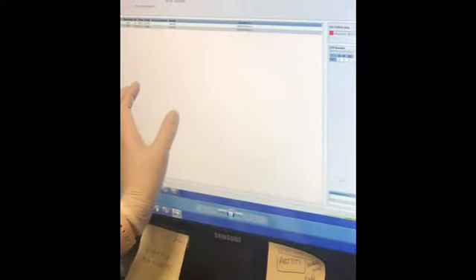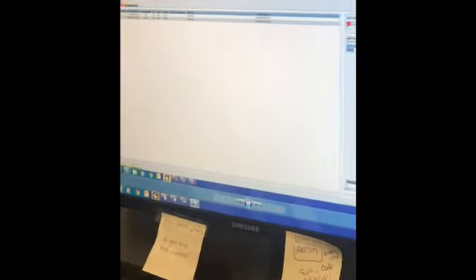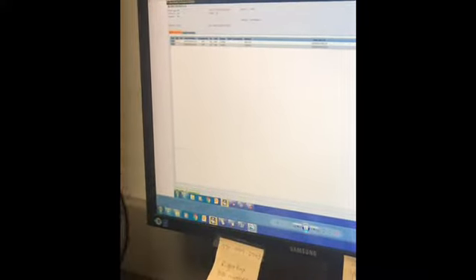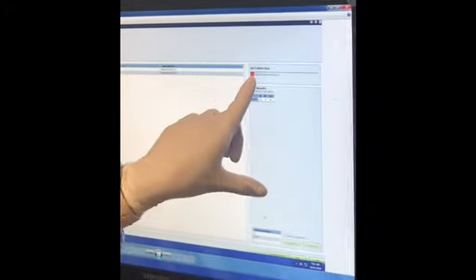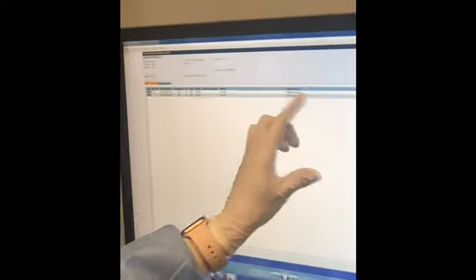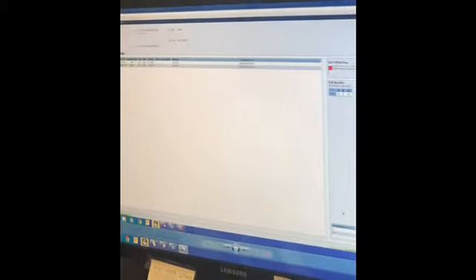That's why I said when it pulls up, verify all your information. It's gonna come from there. Right. Okay. Verify all your information. Make sure everything is correct on how many units you have versus how many you put on there, and that'll let you know if everything has crossed over. If something was wrong, it'll still cross over, but it'll be in red. The unit will be in red, and it'll give you an error message.